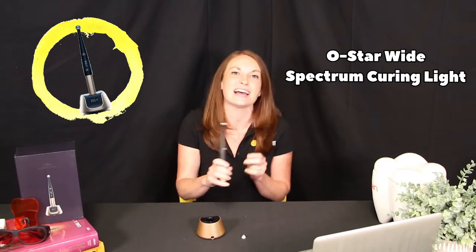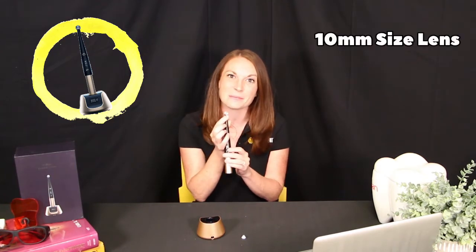The curing light is not only high quality, but it's also an affordable price. It has the full metal frame for increased durability and the 10 millimeter lens.